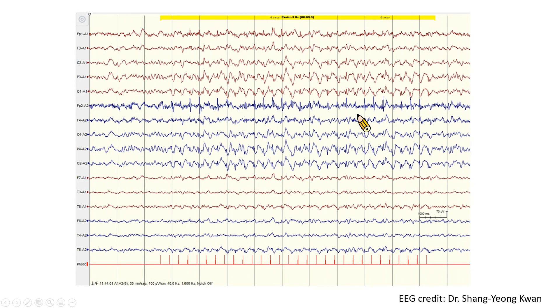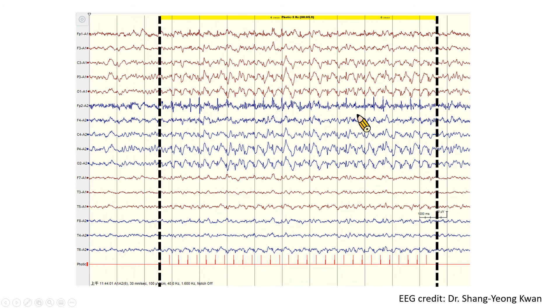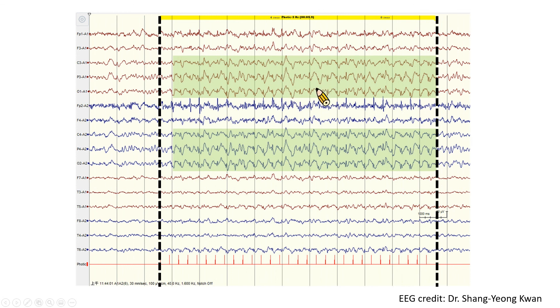Here is another example with a flash stimulus of 3 Hz, in an A1-A2 montage EEG. We can see generalized spike and wave complexes with maximum amplitude over bilateral central parietal occipital regions, which developed as a photoparoxysmal response. The photoparoxysmal response in this patient was self-limited and diminished after cessation of flash stimulus. When we see these patterns via EEG recording, we should check the patient's status. If there is a generalized convulsive seizure attack, we should stop the IPS and stabilize the patient immediately.